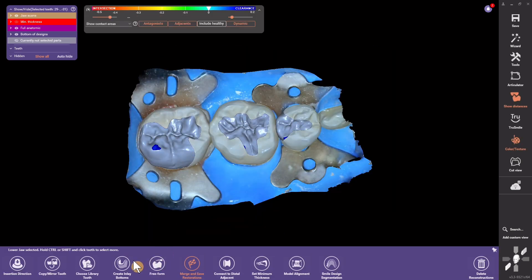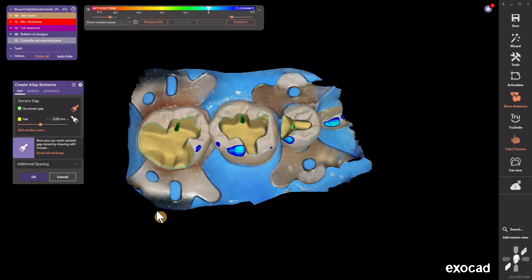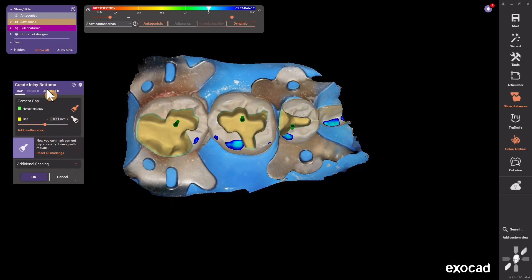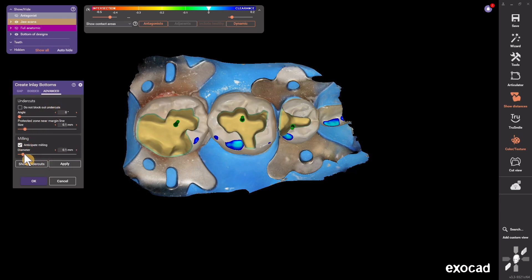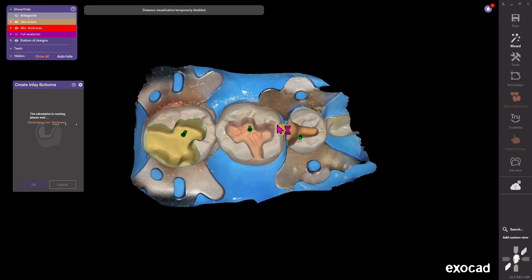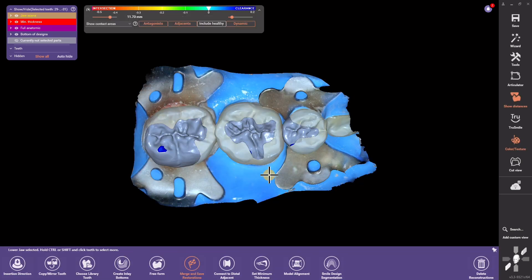It's not like you're recapitulating all the steps — you're just modifying one thing and keeping all the changes that occurred after that step. For example, if you want to change your cement gap because they were too tight and didn't fit, you can come in and increase the cement gap. Or maybe you forgot to anticipate milling and set your tool size. When you click OK, it saves those changes in that particular step while also preserving all your free-forming, proximal contact strengths, and occlusal contacts right where you want them.